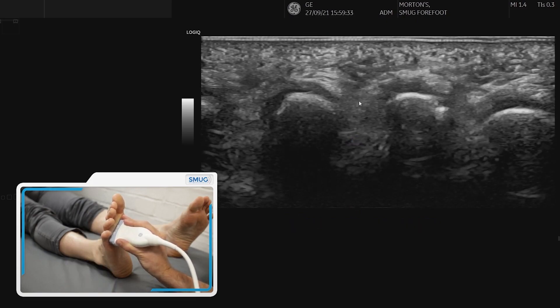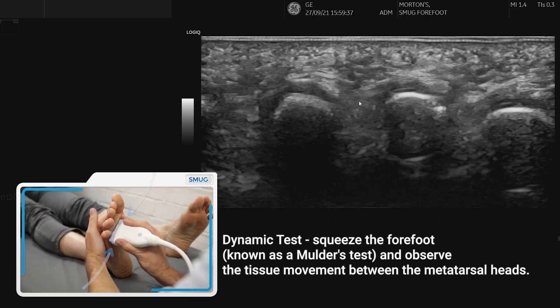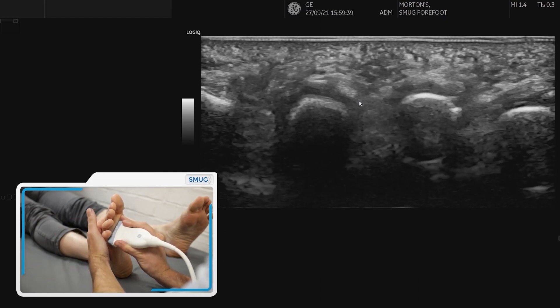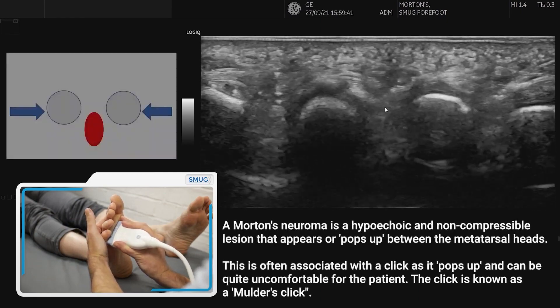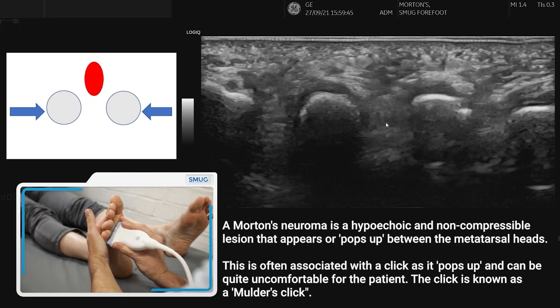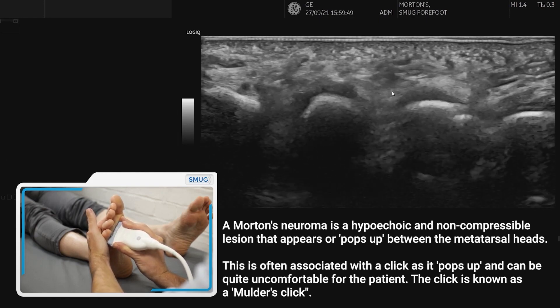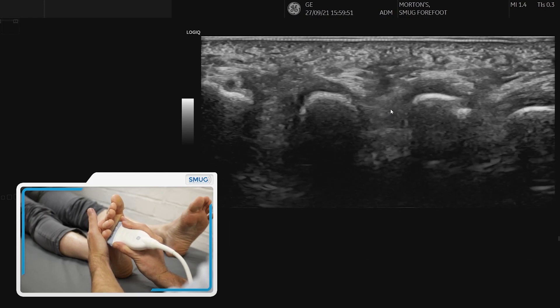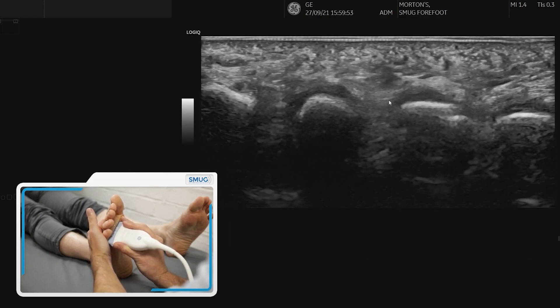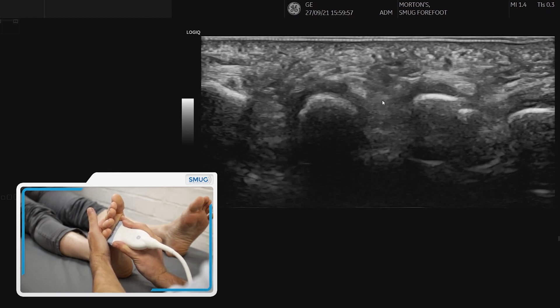We're going to do a dynamic manoeuvre similar to Mulder's manoeuvre to look for a Mulder's click. If we just compress, we're looking for that tissue that comes out between the two metatarsals. If it's a neuroma then it's going to be hypoechoic and non-compressible, and often you will also feel an associated click — and often the patients will feel that too.